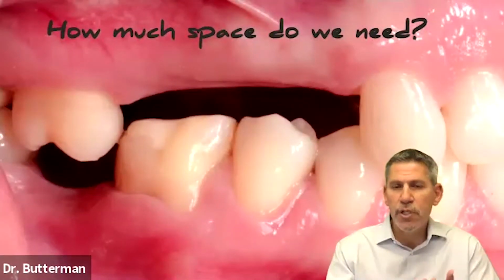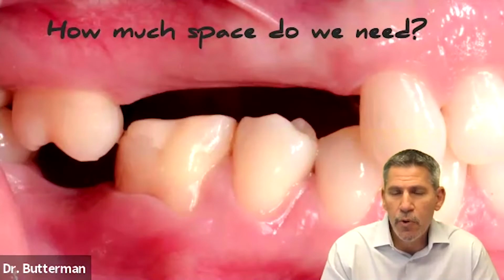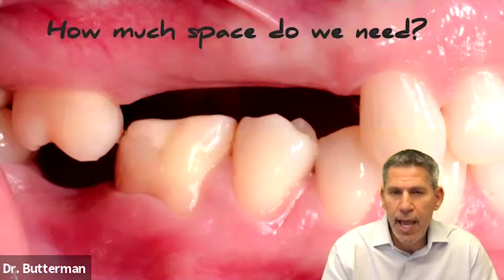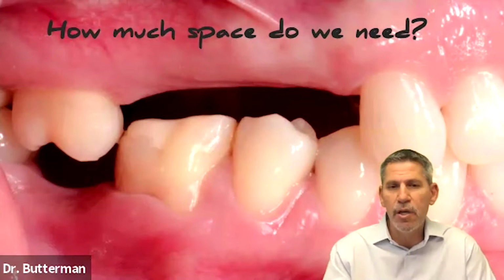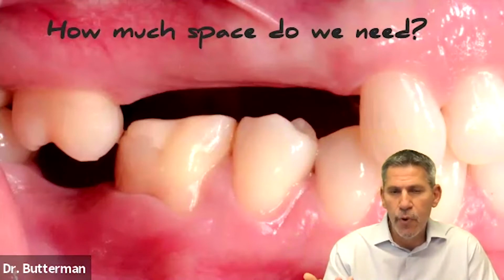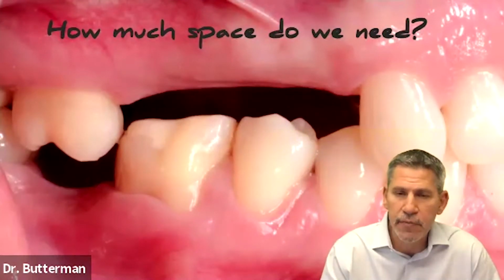Now, if we focus on the implant here and we disregard the restoration, that's when we sort of run into trouble. So when we're evaluating space for a patient, we have to look at a lot of different things. And the first one is, how much room do we actually need, and how do we evaluate that? Because not everybody's going to bite down like this guy, and it'll be immediately clear that there's not enough room for it. So when I evaluate, I'm using 2 main pieces of technology.